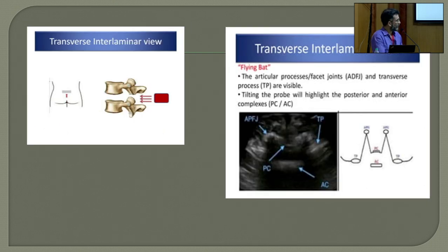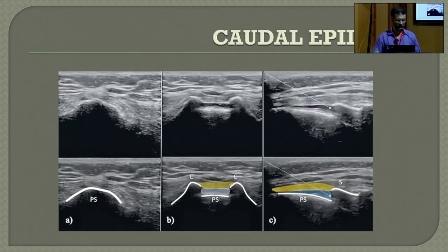Now when I am at the spine, we just move a little and what we get is the facet. These slit-like openings are the facet. So if you are in a hurry, the patient is not able to tolerate that position, and you do not have fluoroscopy, this is something I strongly recommend you can start doing: scan and do a facet block in the short axis view.